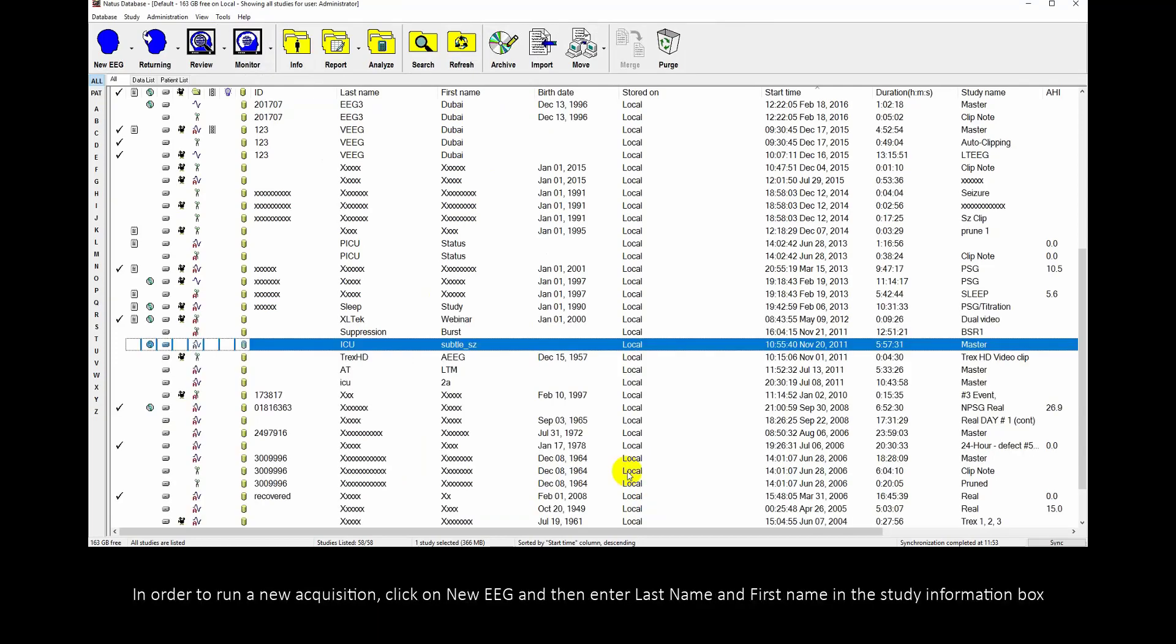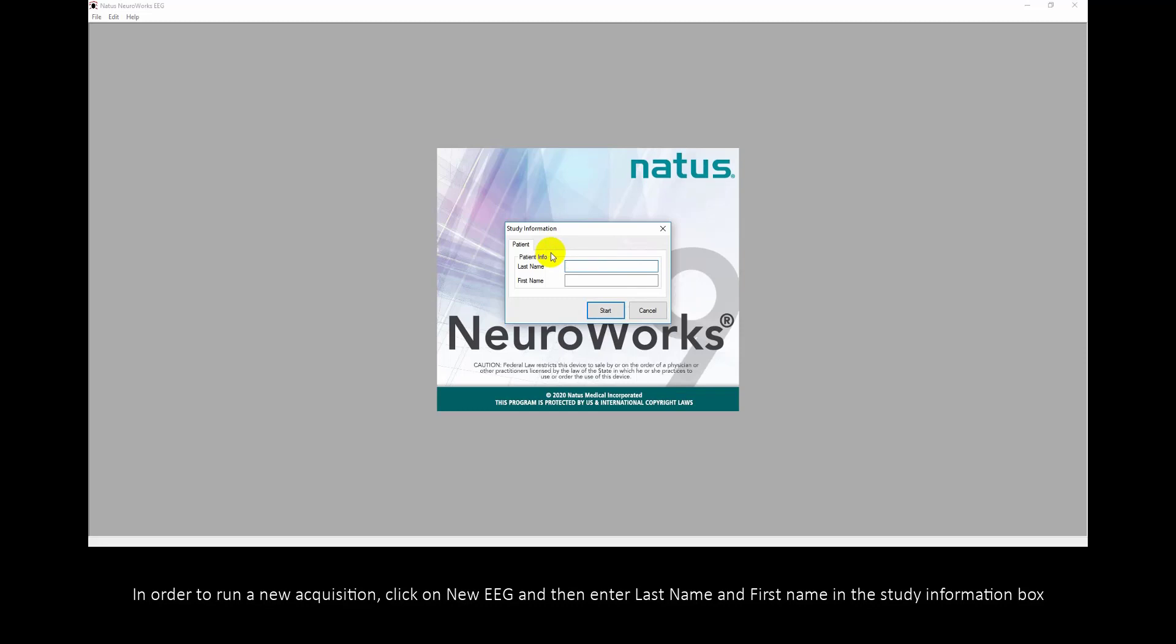In order to run a new acquisition, click on New EEG and then enter Last Name and First Name in the Study Information box.